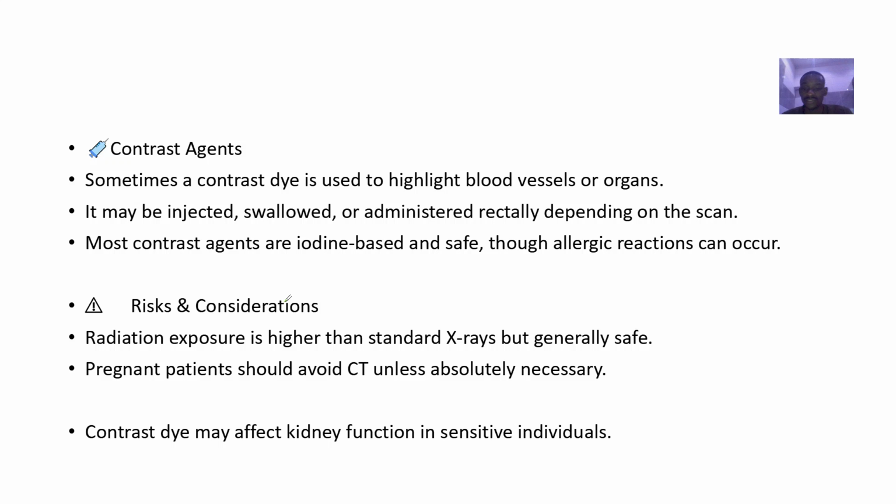Risks and considerations: it uses X-ray, do you understand? So you shouldn't expose the patient too many times. So pregnant women too should also avoid CT scans. Now this is because most of the time it can affect the fetus.